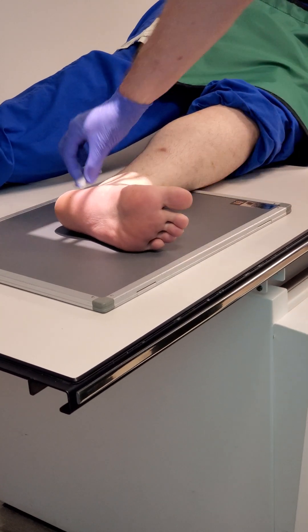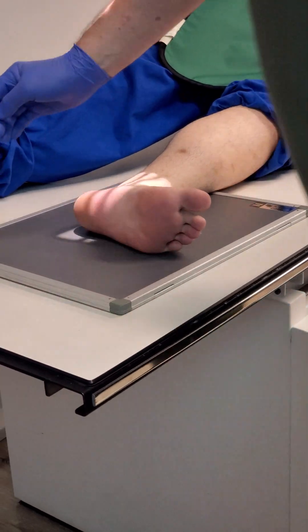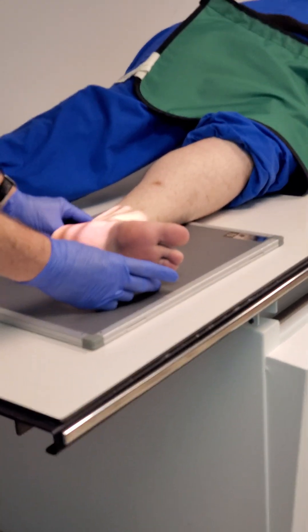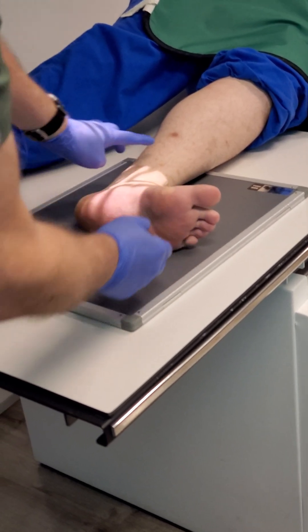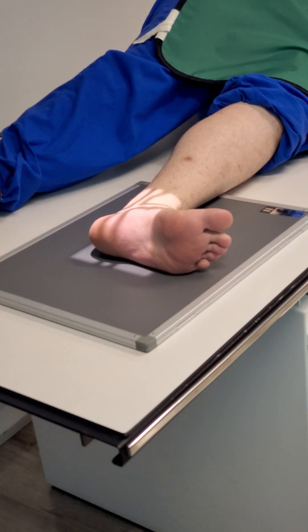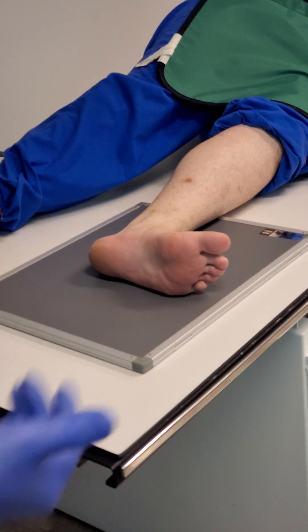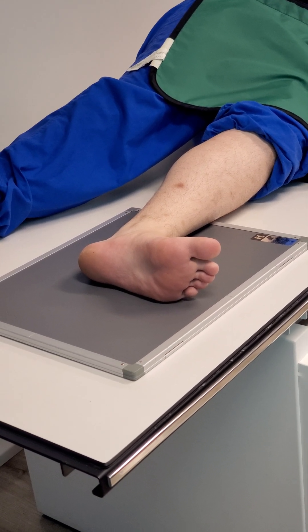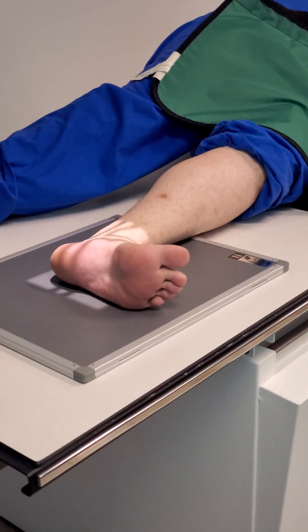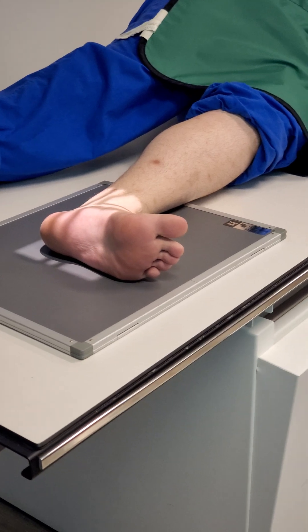Marker is going to go anteriorly, or you can put it posteriorly — whichever side it fits. What kind of angle do we need between the foot and the lower leg? 90 degrees. We are one inch inferior to the medial malleolus. Patient hold still, take a shot. Pretty simple — be sure your SID is right. Any questions? Pretty simple.